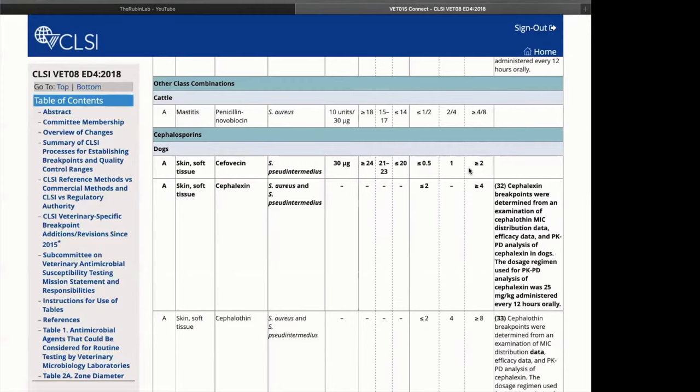Similarly, just to the right, we have our MIC interpretive criteria, where an MIC of less than or equal to 0.5 would be considered susceptible, one intermediate, and greater than or equal to two resistant.